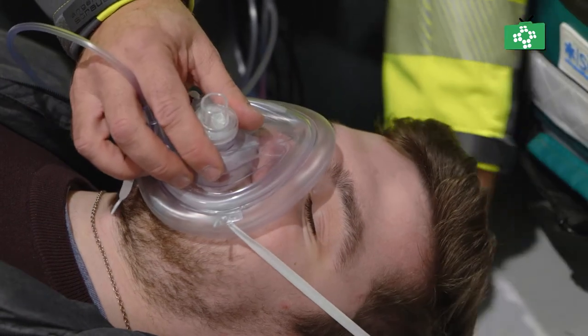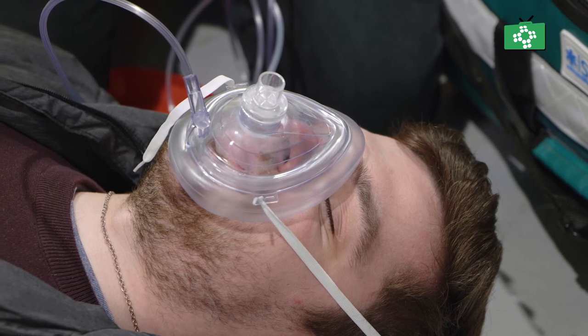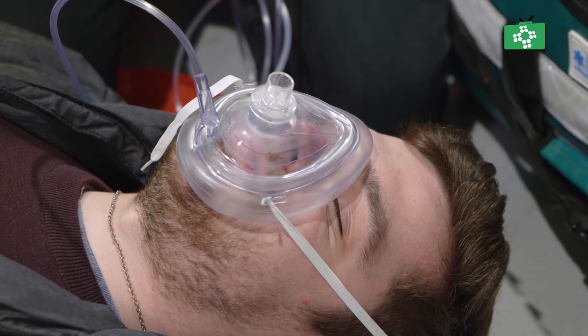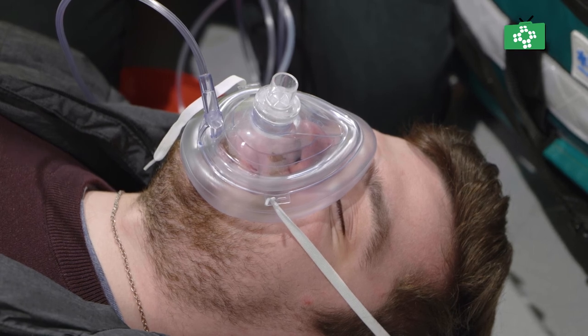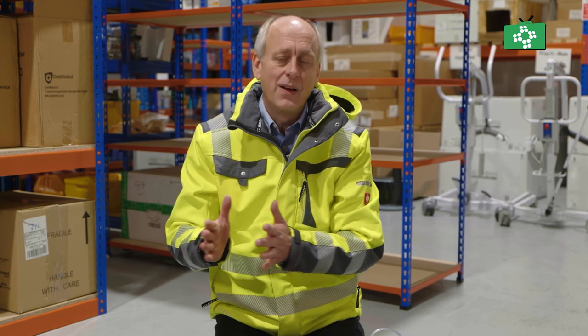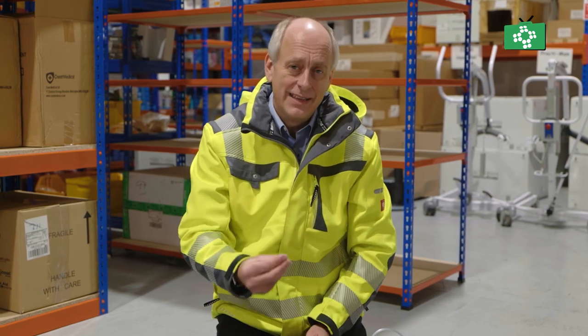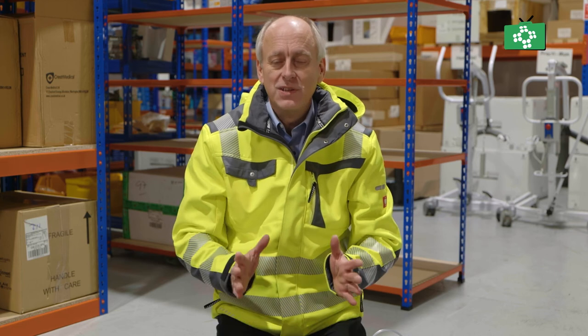Once we turn the oxygen on, pop that over the face — now the oxygen is blowing in. We can give breaths: open the airway and give a breath the same way, but we're blowing supplementary oxygen in. The other advantage of leaving this on is that as we're doing chest compressions there will be an element of air going in and out of the lungs, and at least that way the air going in is going to be as near as possible 100% oxygen.